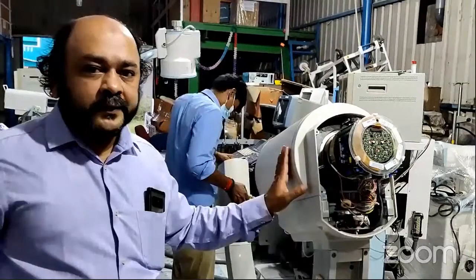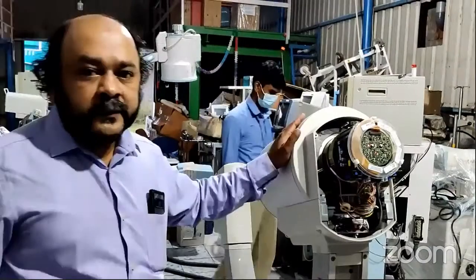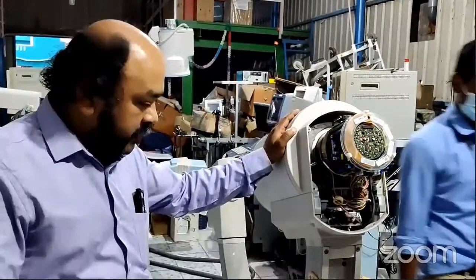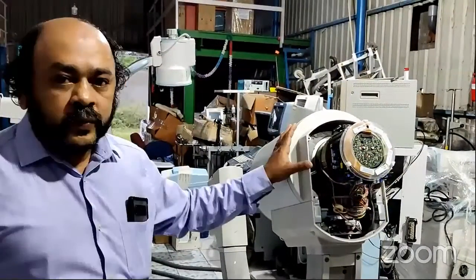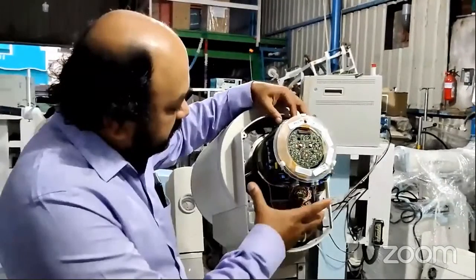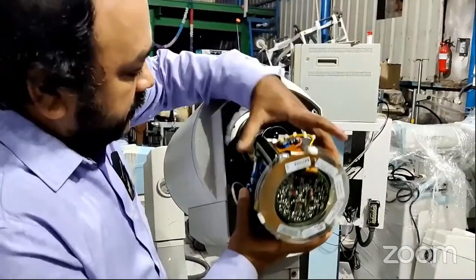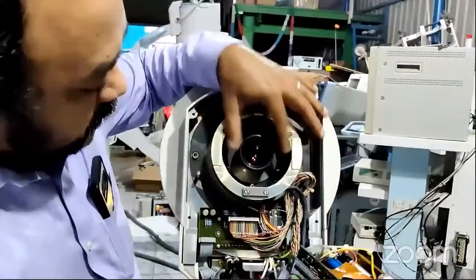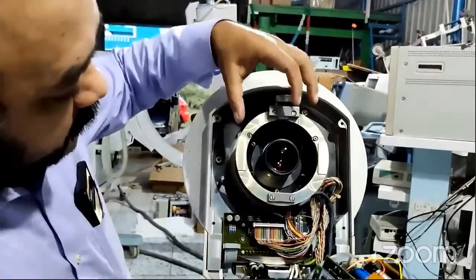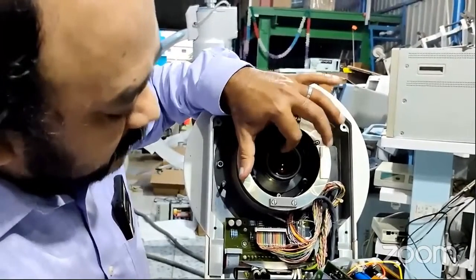So before opening that, you make sure of all the safety features. You have to remove the power cord and other things, then only you open it. This is a camera. See here the tube. The image will come through this lens. This lens will be connected with the camera.